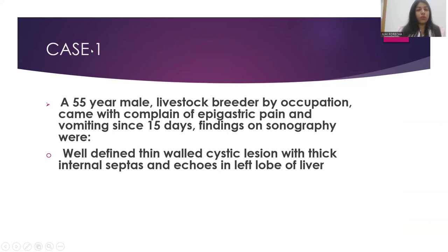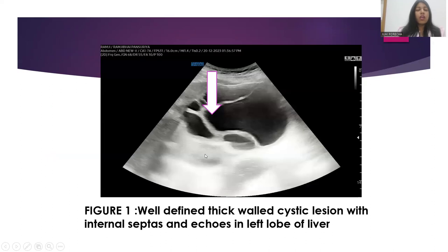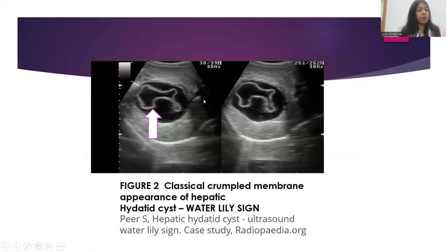Case 1: A 55-year-old male livestock breeder presented with complaints of epigastric pain and vomiting for 15 days. Sonography findings showed a well-defined thick-walled cystic lesion with internal septae and echoes in the left lobe of the liver — classical liver hydatid. Another classical appearance seen in liver hydatid is the crumpled membrane, or the water lily sign, frequently encountered in many cases.